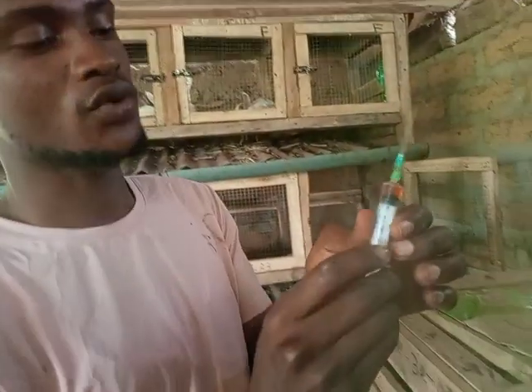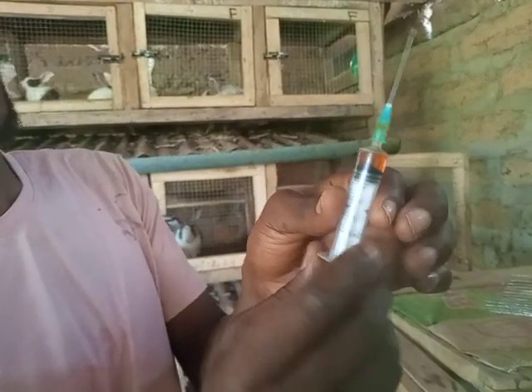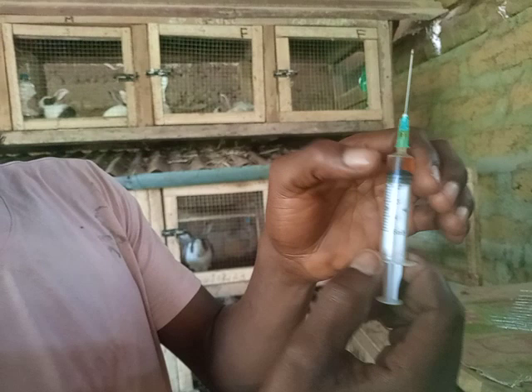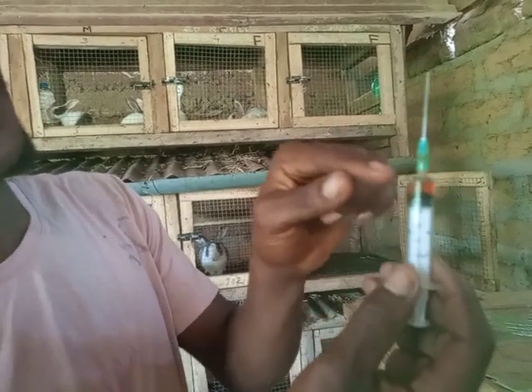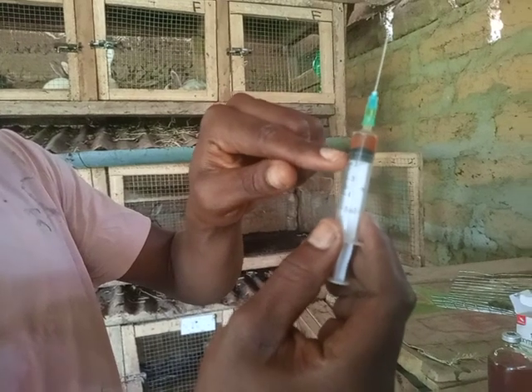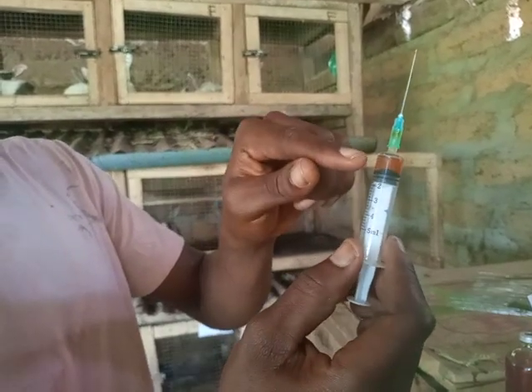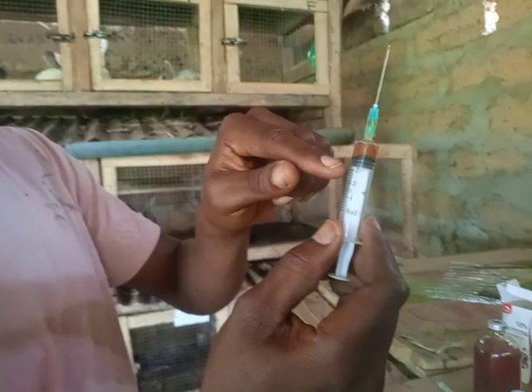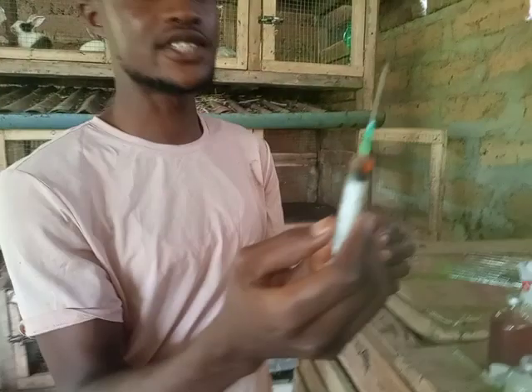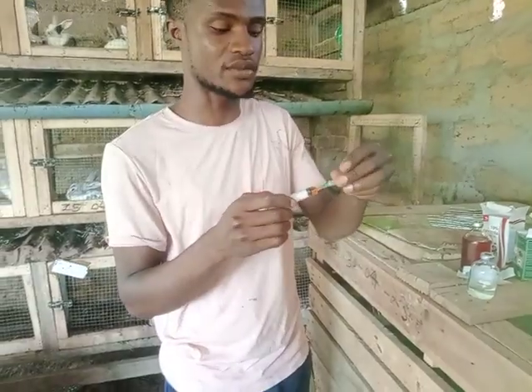You might be tempted to ask how many mils should you give to your rabbits — you try as much as possible to give it one mil. The measurement starts from the top, from one or two to ten, which will give you one, so 0.1 mil, 0.2 and so on until you reach one. Upon getting this, you close it again and go to the animal, which is a rabbit.